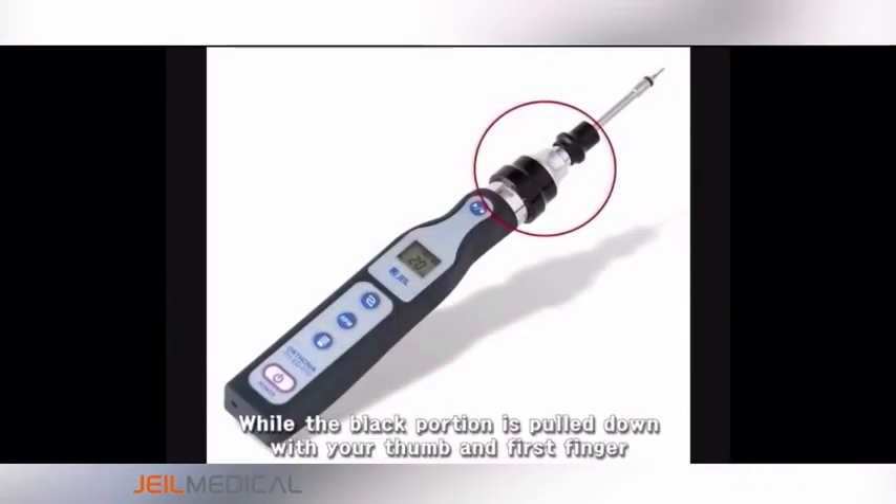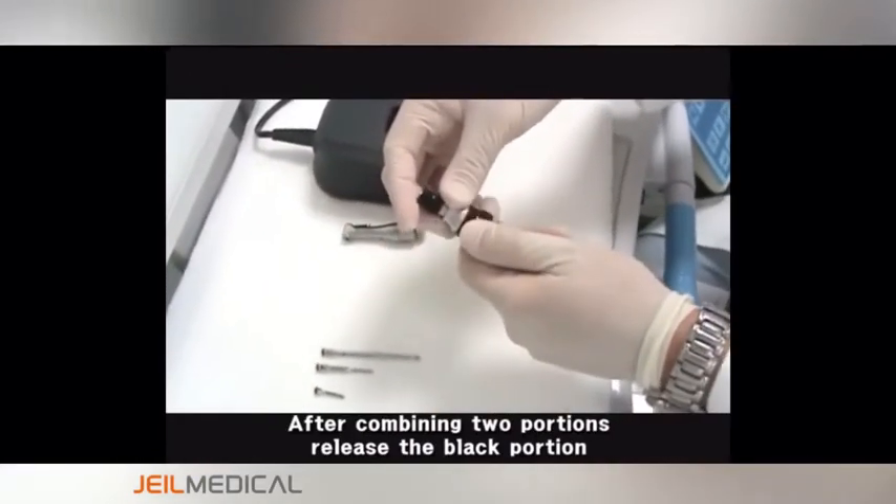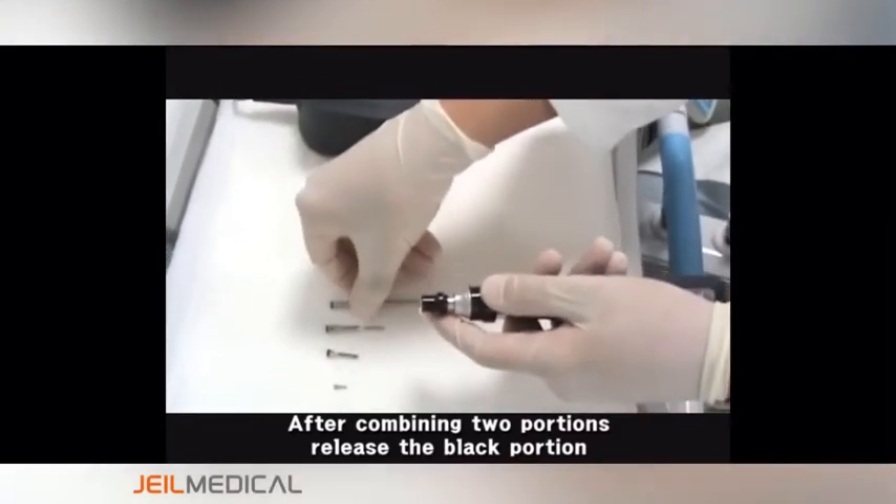While the black portion is pulled down with your thumb and first finger, put the chuck into the Olsonia main body. After combining two portions, release the black portion.